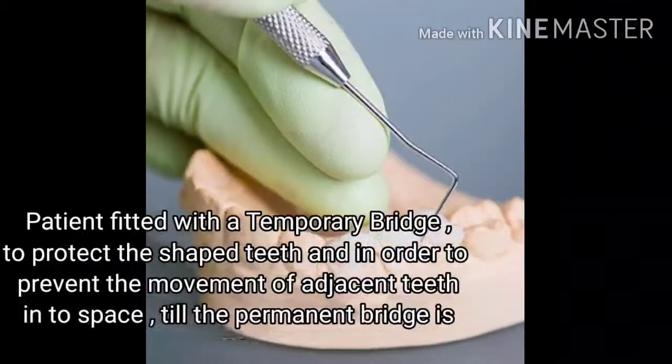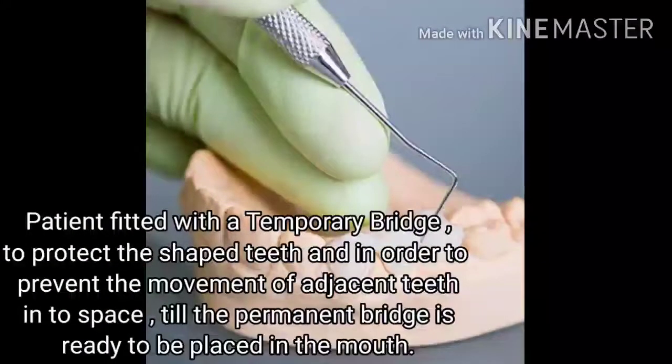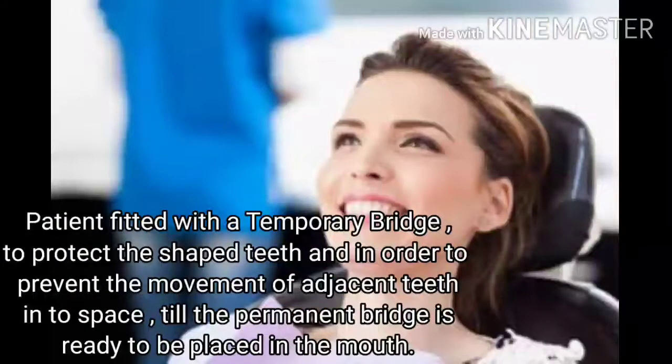The patient is fitted with a temporary bridge to protect the shaped teeth and in order to prevent the movement of the adjacent teeth into the space, until the permanent bridge is ready to be placed in the mouth.